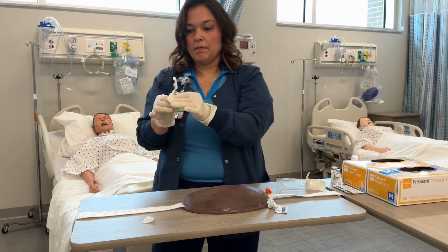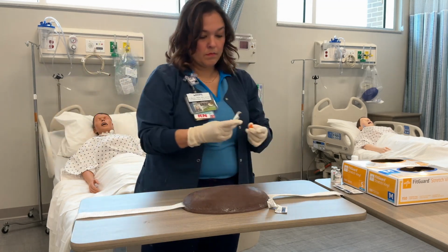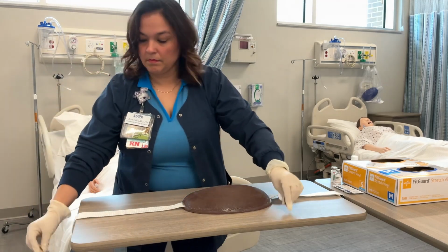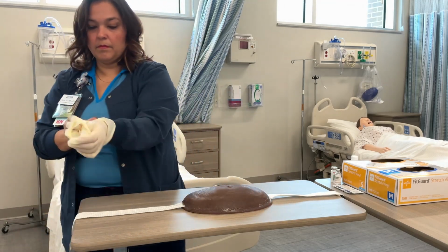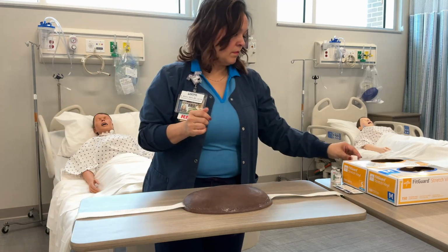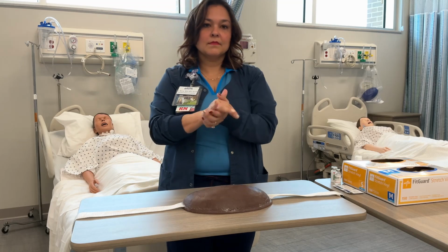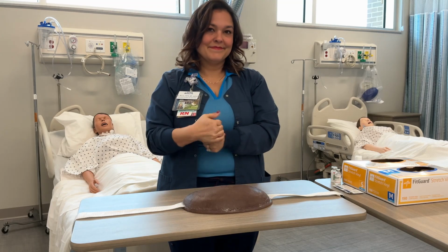Do not massage our insertion site. Discard the needle in the sharps container. Remove gloves and wash hands. We're going to observe the injection site for bleeding or swelling or any signs of adverse reaction. We're going to document on the MAR and nurse's notes and monitor our patients for signs and symptoms of hypoglycemia. Please let us know if you have any questions.